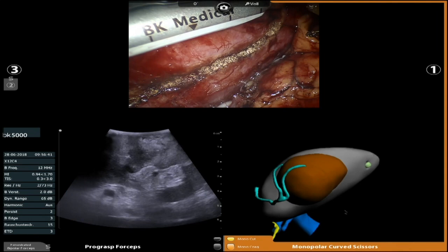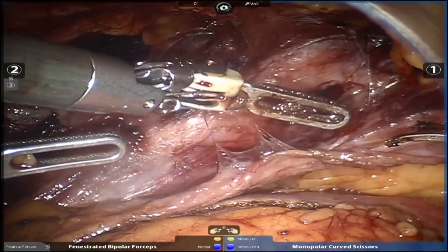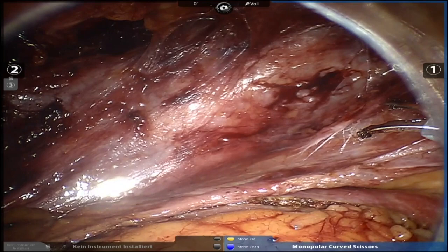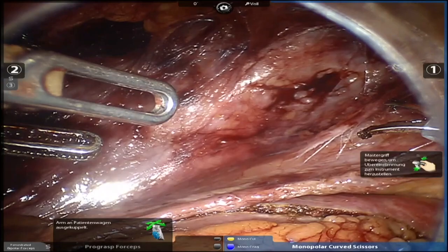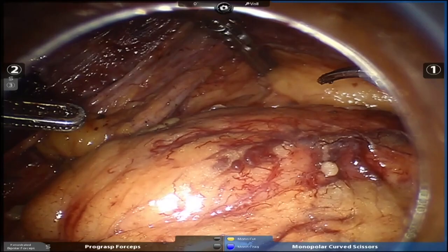Okay, ultrasound out, please. Take it out. All right, so let's change the two instruments here, Brandon. We're going to exchange these two. Okay, so take them out and exchange them. Okay, go ahead. So what I'm going to do is switch my retracting arm to the arm closest to the camera. In this case, my number two arm. And then I'm going to put my prograsp more anteriorly. And the reason for that is that when I pull up, I'm coming down on my assistant, and then my assistant has no ability to help me. And I don't want to do that.